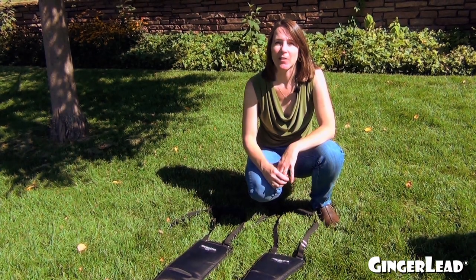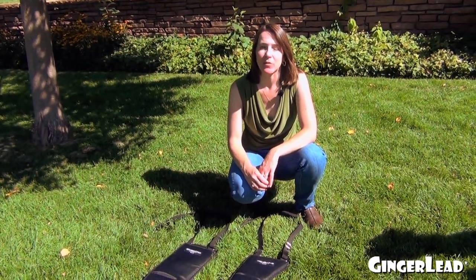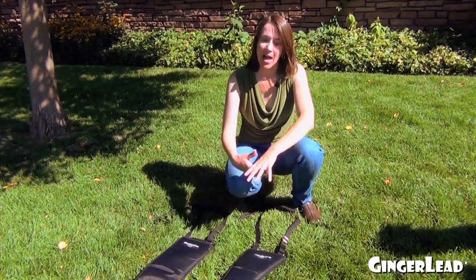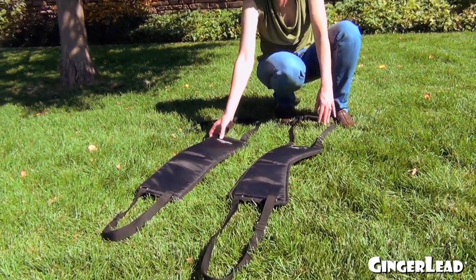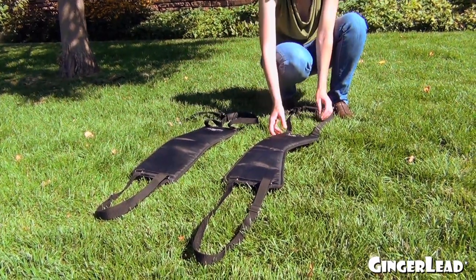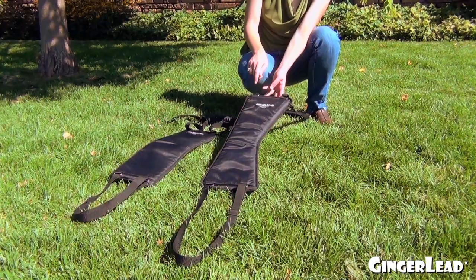Hi, I'm Liz with Gingerlead Dog Support and Rehabilitation Harnesses, and I'm going to give you some tips on how to use a Gingerlead. In front of me, I have a large male and a large female Gingerlead. The female Gingerlead is rectangular in the pad, and the male Gingerlead has a cutout in the support pad for the boy parts.